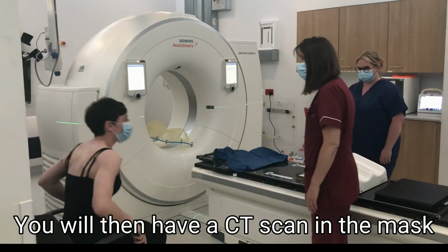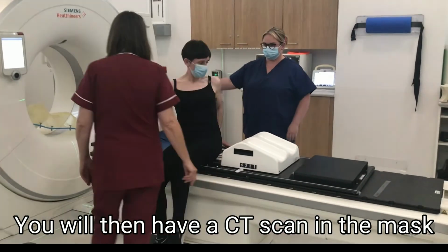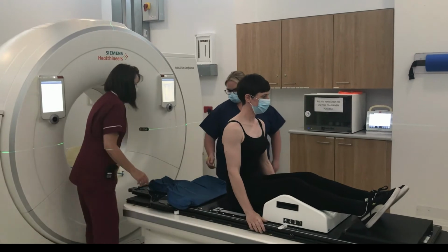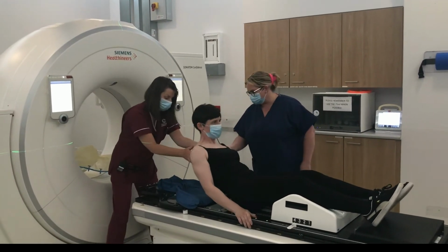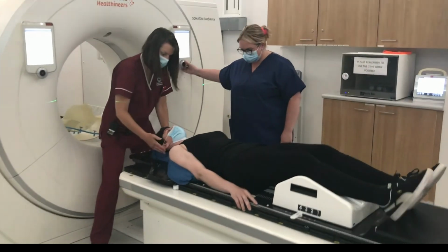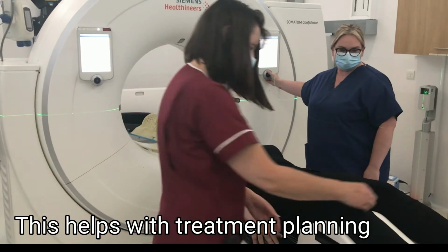Once the mask is made, we will move through to our dedicated scanning department where a CT scan of your head and neck is performed. This CT scan is relatively quick and is performed with you lying down on the scanner bed with your mask on. To help us visualise the area that we may need to treat, you may require an injection of contrast dye.